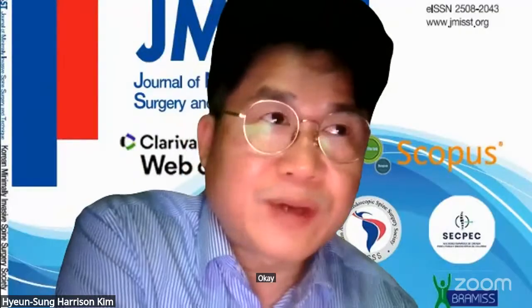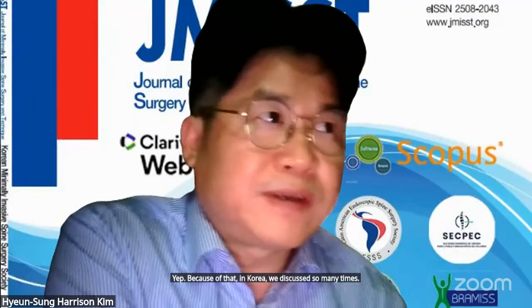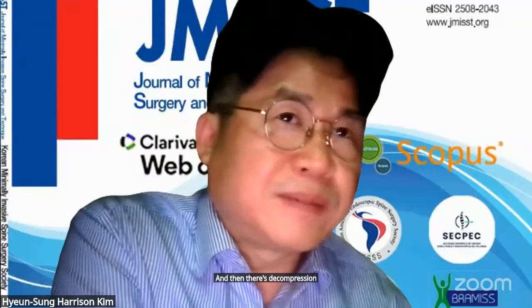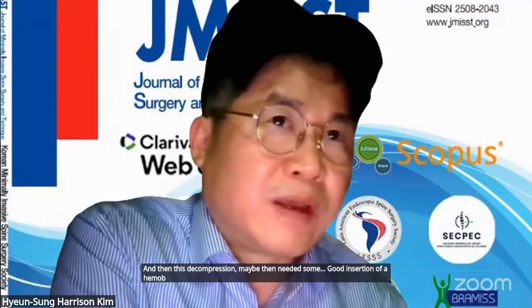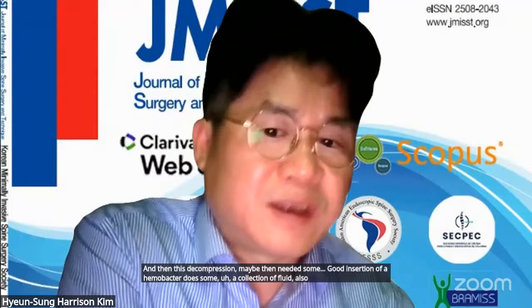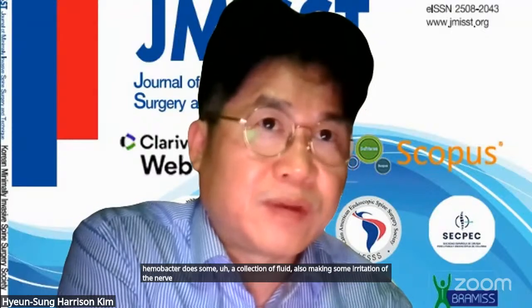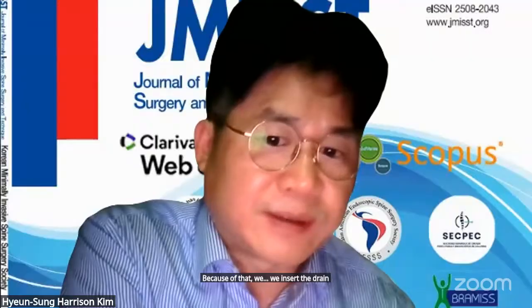After the surgery, you put a hemovac, yeah? Yeah, in Korea, we discussed many times that in endoscopic decompression, they may need insertion of a hemovac because a collection of fluid can irritate the nerve and post-operative irritation pain may happen. Because of that, we insert the drain for 1 or 2 days.